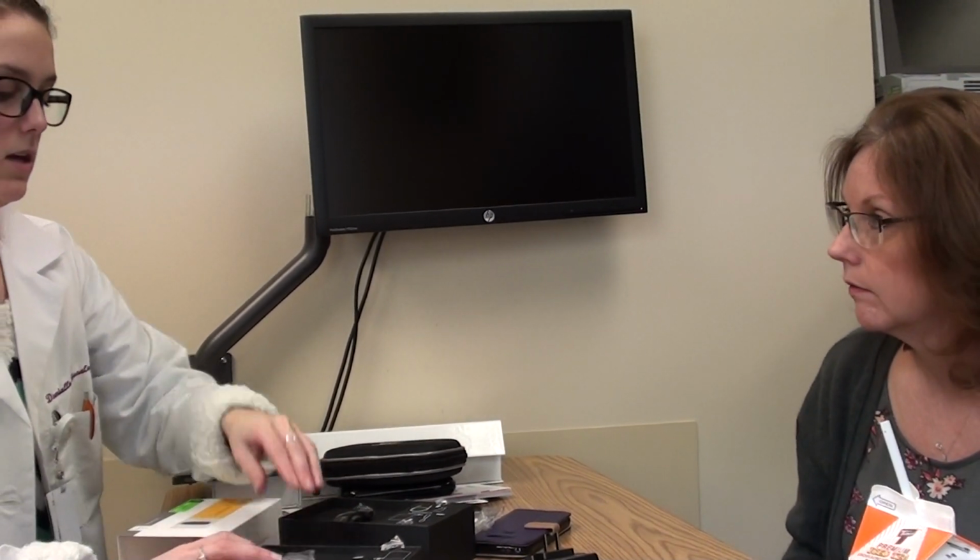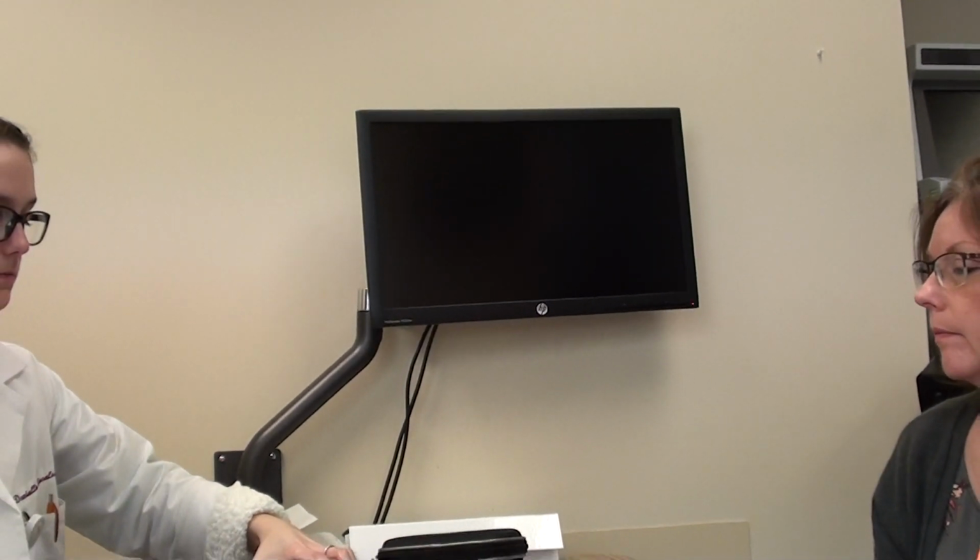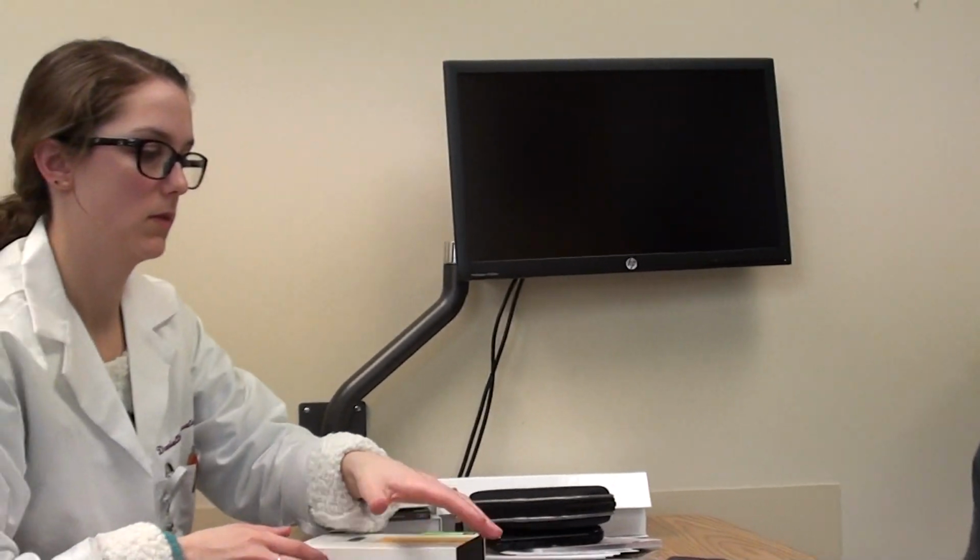This is the phone clip, so you'll be able to hear the phone in the implant. And this one is a little microphone, so if someone is sitting across from you, they could wear it and you'll hear it straight to the implant. These are those accessories we talked about when you came in for the pre-testing, that you had to pick the 4 accessories. Those are the ones you decided that you wanted.